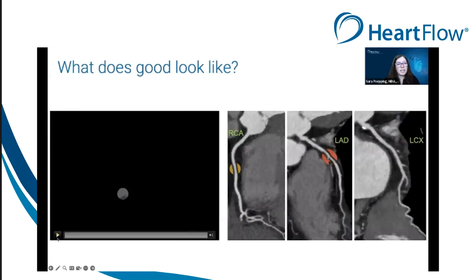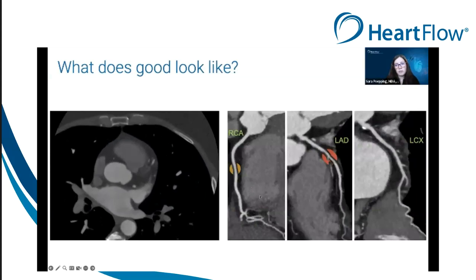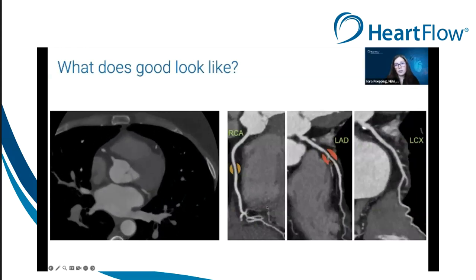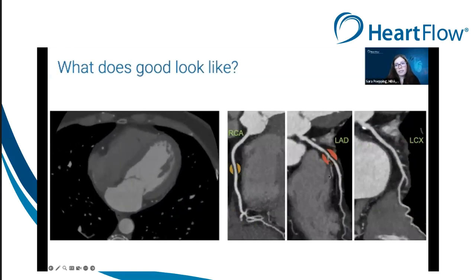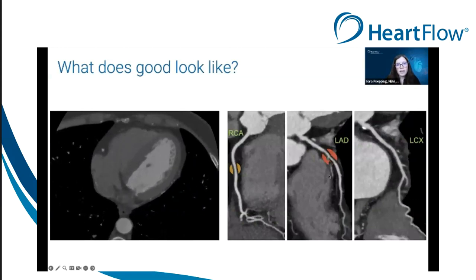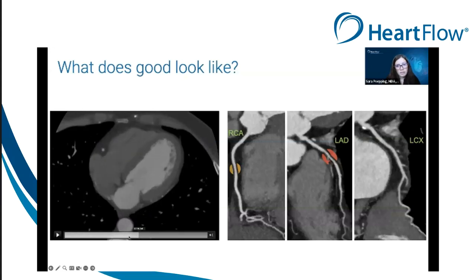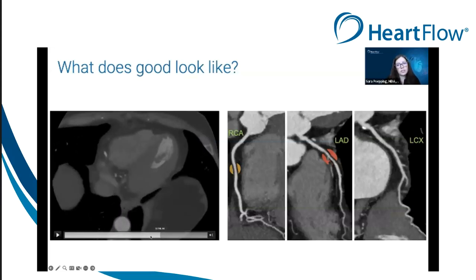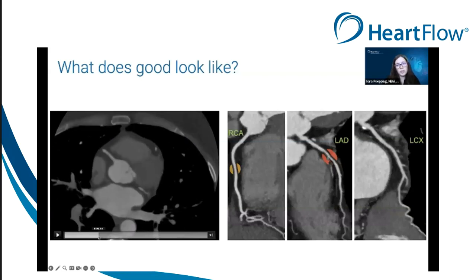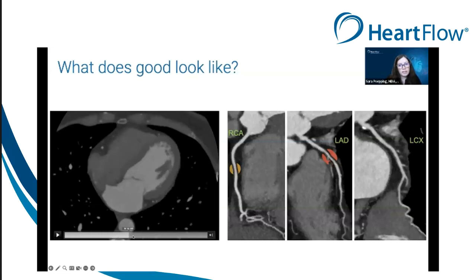This is an example of a coronary scan with excellent image quality. There's minimal cardiac or breathing motion, and we can confidently follow the lumen of each of the epicardial arteries. In the LAD, there's a moderate amount of non-calcified plaque and we can confidently discern the lumen boundary. There's appropriate contrast timing with contrast flushed through the right side of the heart, nicely highlighting the left ventricle, an appropriate radiation dose with minimal noise, and all coronary arteries and myocardium are present.